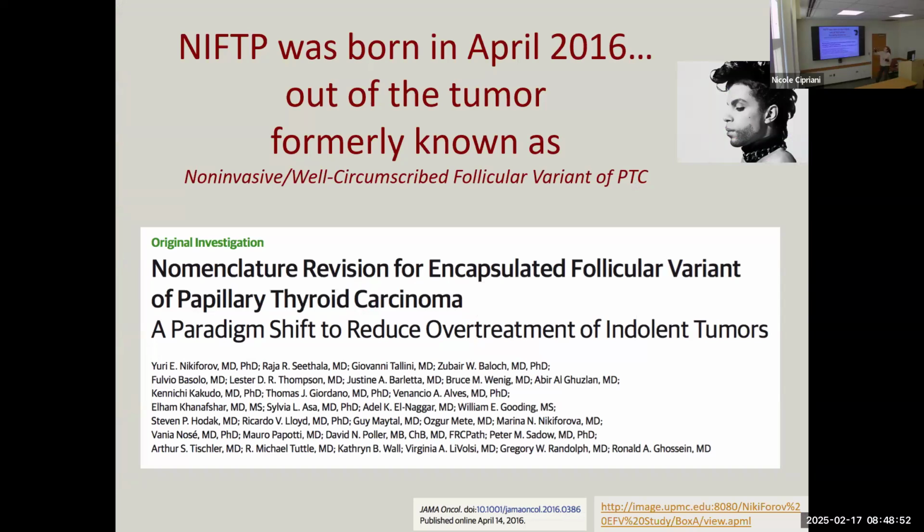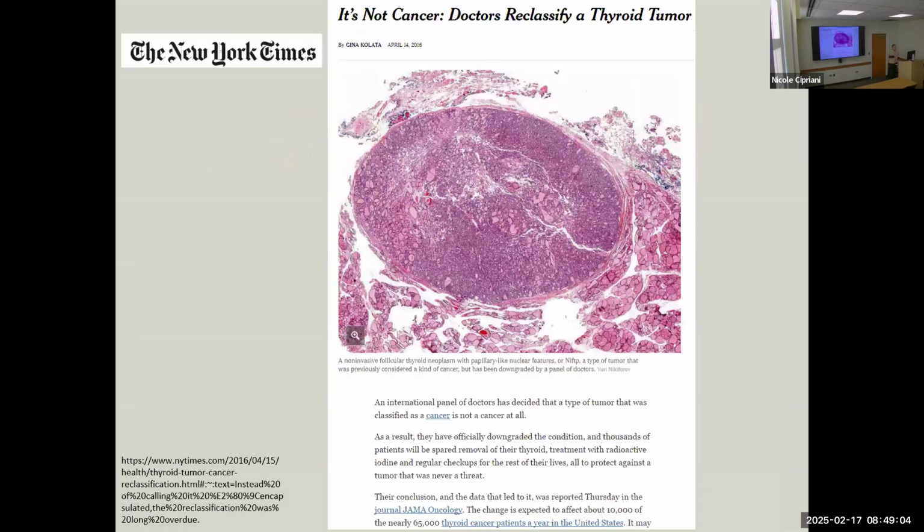So NIFTP was born in 2016 out of the tumor formerly known as non-invasive follicular variant of papillary carcinoma, okay? This was written up in the New York Times because it was such a huge shift. Doctors reclassify a thyroid tumor, it's no longer cancer. When you look at this on low power, you're like, that is a follicular adenoma, right?